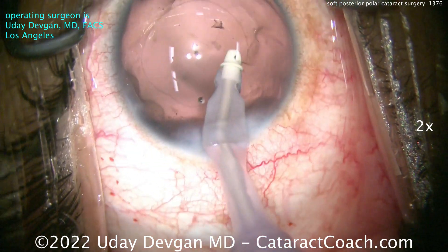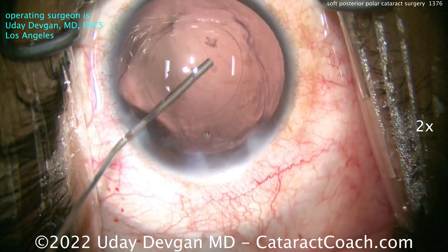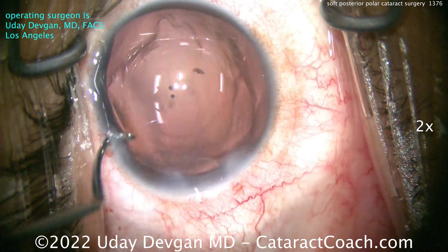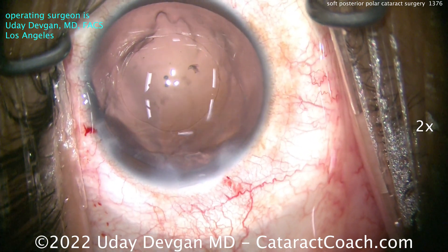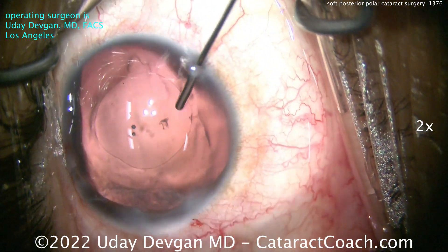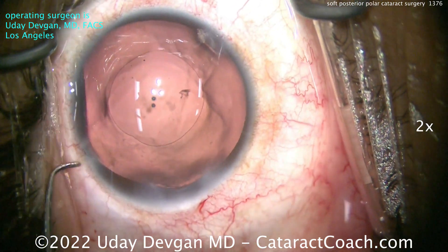We're fortunate that there's really not much opacity stuck on that posterior capsule. Now, cohesive viscoelastic is going in before taking out the phaco probe. The trick there is to go to position zero as you start injecting — if you're on position one, you'll just wash out all the cohesive viscoelastic. As you put the cohesive in the eye, inject it with the left hand, hold the probe still with the right hand, and go to position zero. Just cleaning up a little bit of cortex in the capsular bag — there's some sub-incisional cortex to get out. I'm going to make another paracentesis; I just can't risk anything in this eye. Going in with BSS on a cannula into the sub-incisional space works very well. The added benefit of an extra paracentesis hurts no one and helps you tremendously.